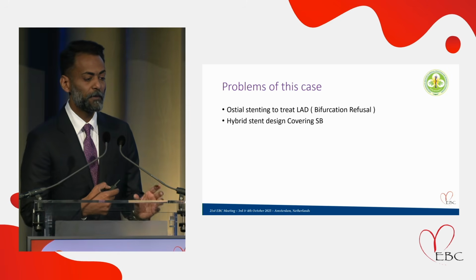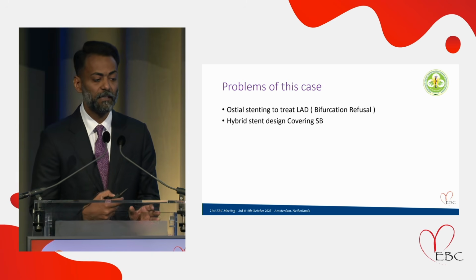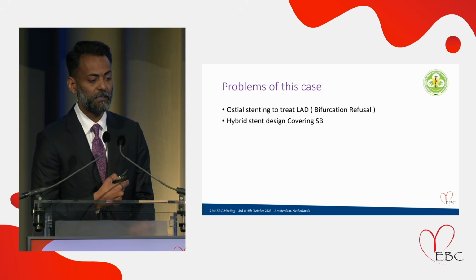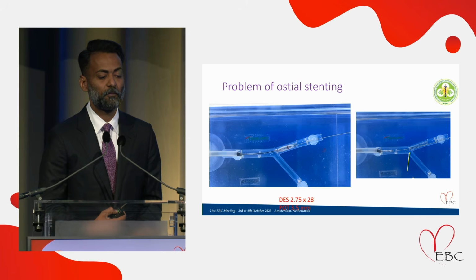So we had two problems in this patient. One, as Dr. Remo said, problem of ostial stenting, and the second was hybrid stent design. I think there is a problem of ostial stenting because of various reasons. This is what we published last year of modified POT.